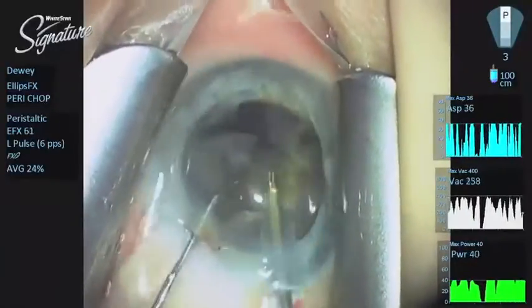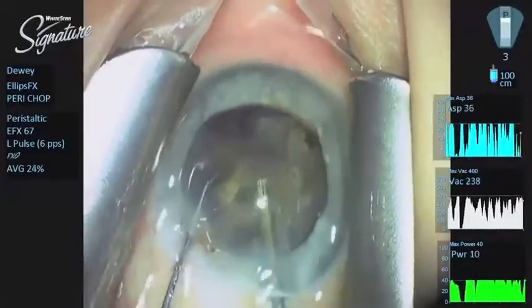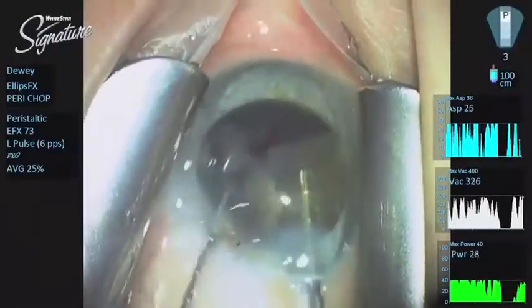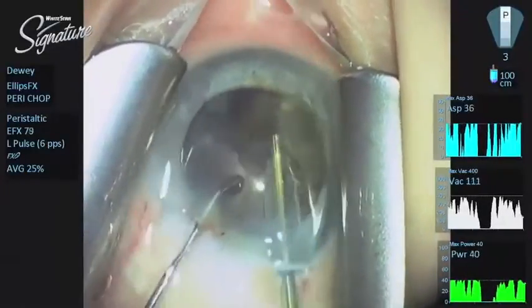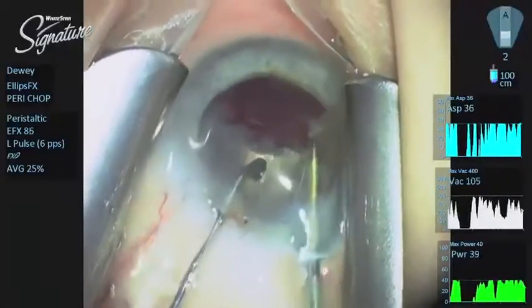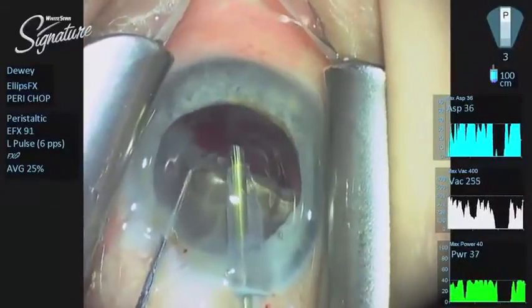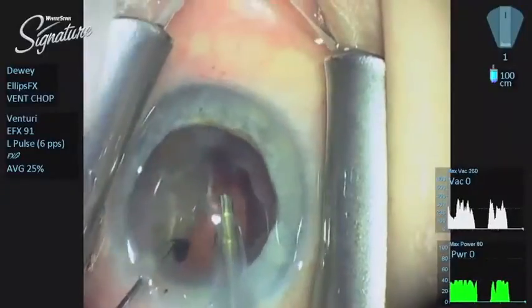We are pretty much through the back plate — there may still be a little bit at the point of the cloverleaf that connects it, but there really wasn't. We are going to take out the second quadrant. You are about to see one of the magic features of fusion fluidics: the ability to switch between peristaltic and venturi vacuum on the fly. The last little fragment of the peristaltic half of the surgery is going to disappear into the lumen of the needle. Notice the aspiration graph just vanished — we switched over to venturi vacuum.